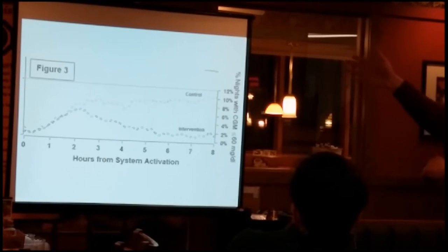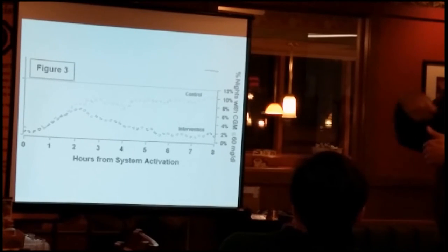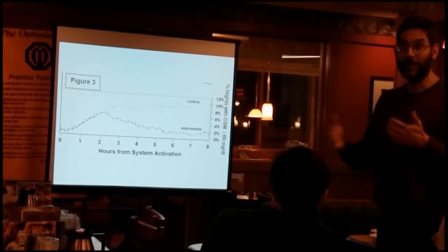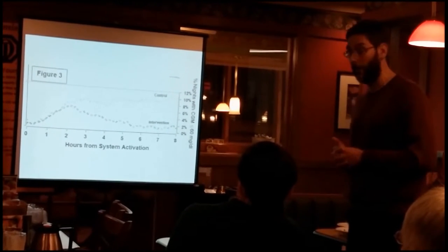just over nighttime. The reason we studied this first at nighttime is it's easier because you don't have food coming in, you don't have exercise coming in to affect the blood sugars. And also, I think it's when parents, at least, have most fear about the child going low.